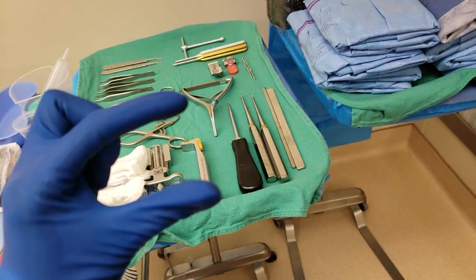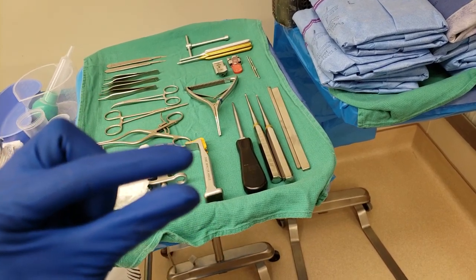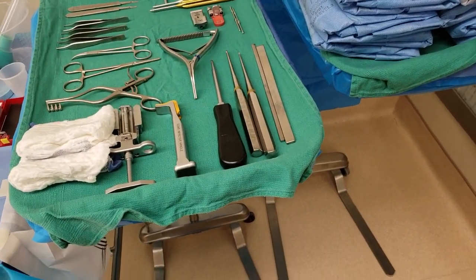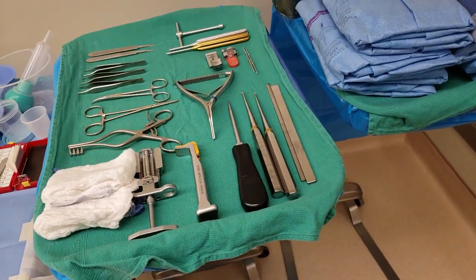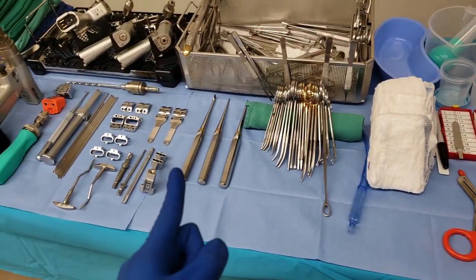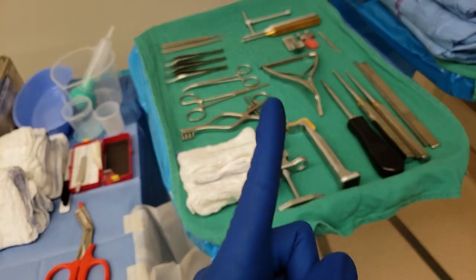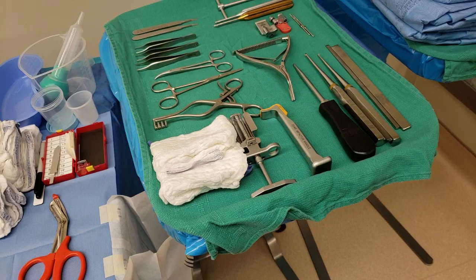They kind of go from like 1 inch to bigger than that and bigger, and then down to 1/4, or yeah, smaller. And they also vary in the tips. It could be curved, it could be straight. And so far what I have here is, I believe, 1 straight and 1 curve for the 1/4. You have curettes over here, and I have more over here that are bigger on the tips. And that is a lamina spreader. I currently opened the small one, and I got a larger one in the room that is not open yet, just in case I need it.